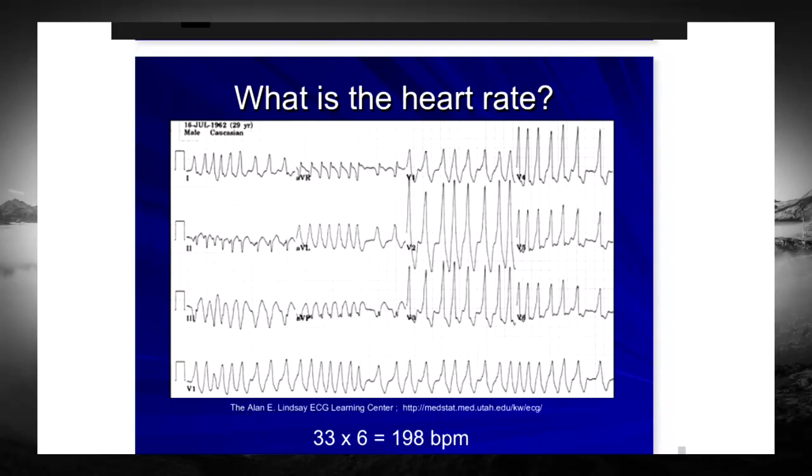So you can see in V2 how high this QRS complex is, right? Let's say this was a patient who came in and said, a couple of weeks ago, last week I fainted, and they said, oh, let's do an ECG. And it comes off, and that ECG could look completely normal. However, if this box here was cut in half, what that means is that the computer was trying to make it easier for you to read.